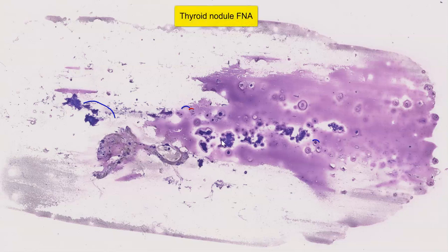This is an air dried smear from a thyroid FNA, and this is a left thyroid nodule. At low magnification, we can see that the cellularity is relatively low, and that there is quite a lot of this purplish colloid in the background. There are also some empty spaces, as you can see here.